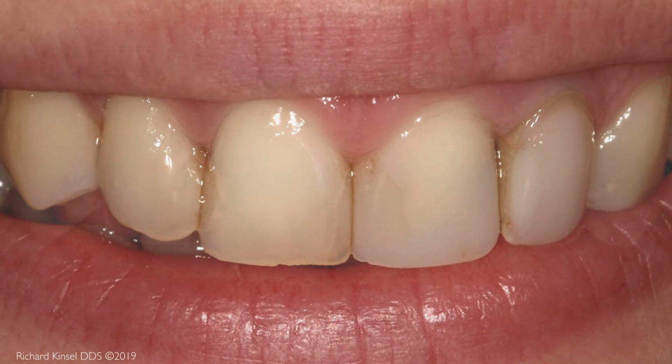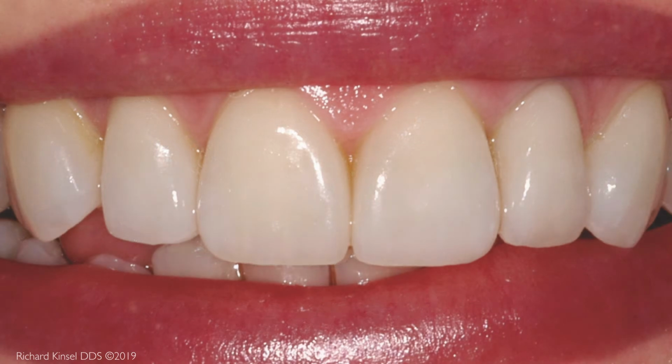These are the final all-ceramic crowns. Porcelain veneers were also placed on the canine teeth to complete the smile design. We now have porcelains available that allow the dental technician to duplicate natural teeth. Also note the healthy surrounding gum tissue.